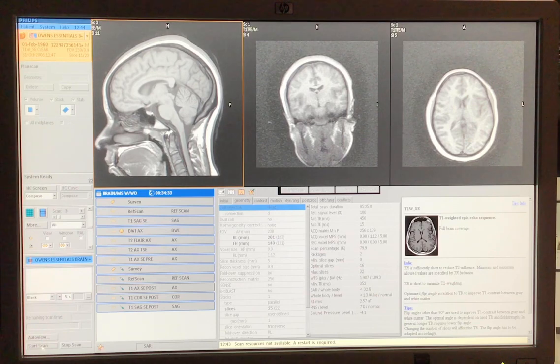Okay, so real quick, one more thing. I want to reiterate that all of these parameters, when you're trying to understand what do I do for TR, what do I do for TE, what do I do here, that is all listed in your MRI Handbook of Scanning, that little flip book. Bring that in with you. So anytime you question something, you can refer to that and say, oh, okay, well, this here in the book says it uses a TR of this and a TE of that. I mean, that will help you. Those are guidelines for you, okay?